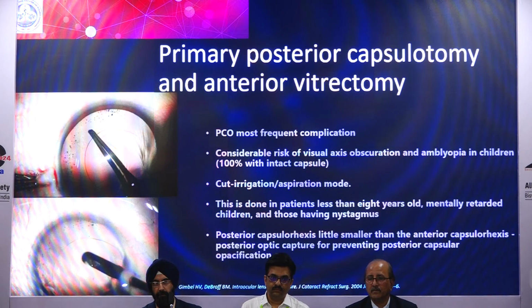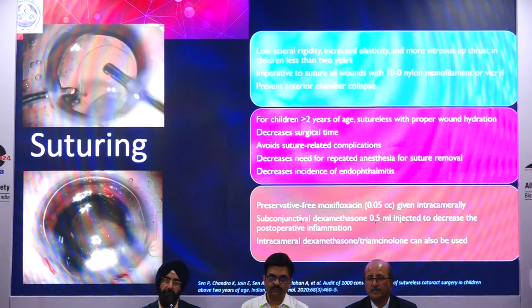So this is done in children under 8 years of age, but capsulotomy and vitrectomy is done up till 6 years, and we do just PCC till 8 years of age, or in children who are mentally retarded or cannot cooperate for a Nd:YAG capsulotomy later on.